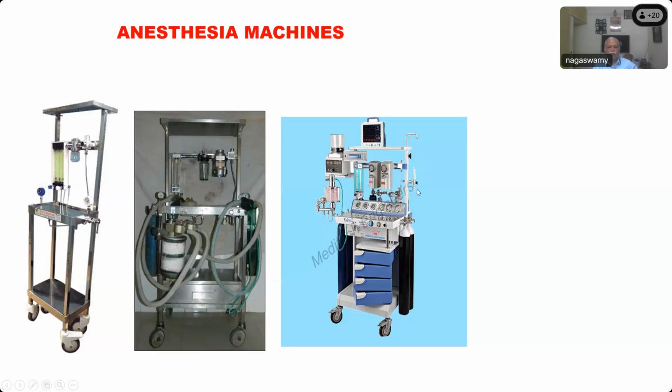Auxiliary oxygen flow meter. Okay, so this has become a little bit more advanced than what you saw, but you can see the caster wheels are still being maintained because we want to rotate or move the machine in all 360 degrees. We still have the caster wheels, the same thing is going on.